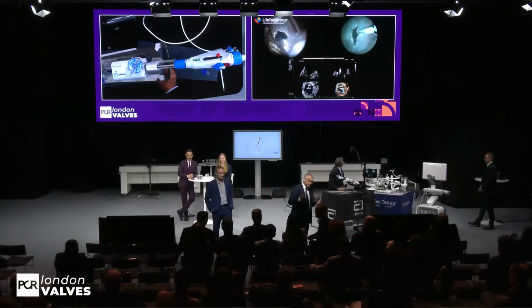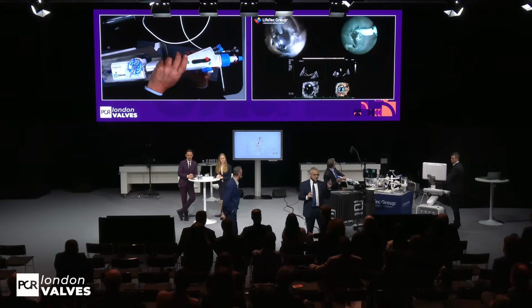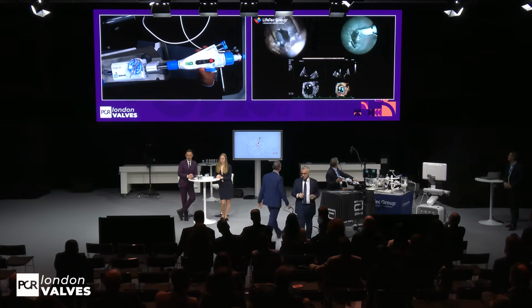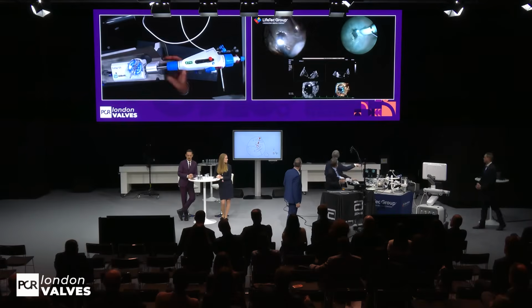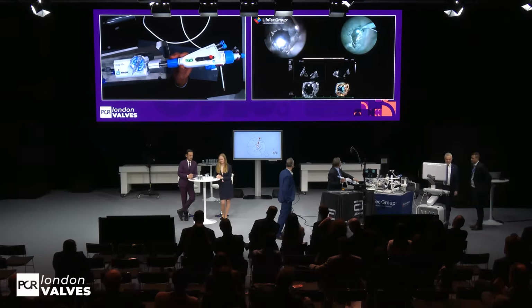Most of our procedures require transgastric. Why? Let's see if anyone in the audience has the answer. The answer is in the picture you see in the simulator. Can we have a transgastric view on echo? Not from this one. Or maybe even from this one. You cannot have transgastric, correct?